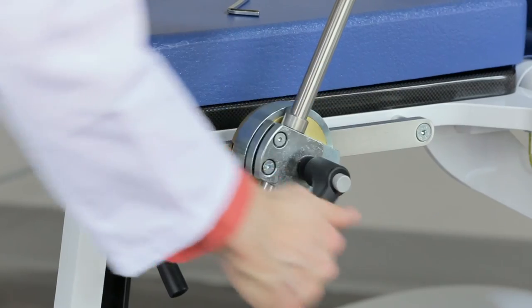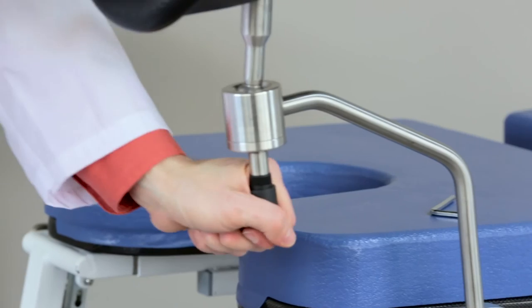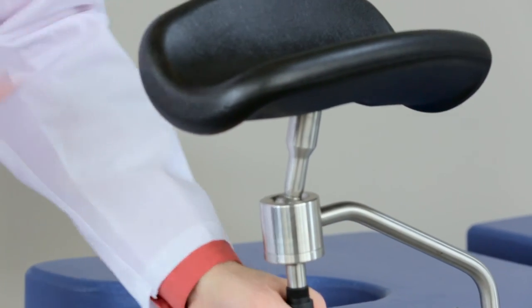Insert the leg rest into the holder, adjust the height and angle to your preference, then rotate the handle on the leg rest holder clockwise to lock it into place. You can adjust the angle of the leg rest pad with the swivel directly underneath it.